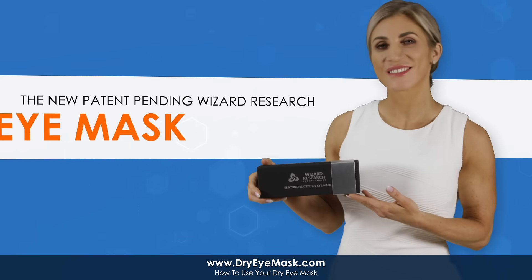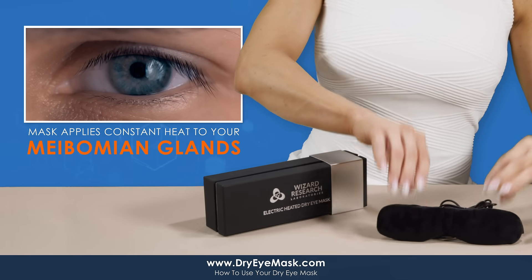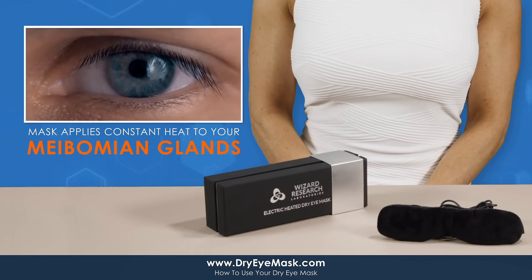This is the new patent-pending Wizard Research Dry Eye Mask. The mask applies constant heat to your meibomian glands to relieve your dry eye symptoms.